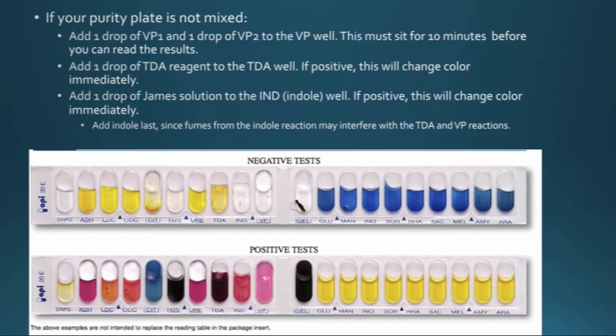After that, add one drop of the TDA reagent to the TDA well — if it's positive it will automatically turn a very dark brown. Then add a drop of James solution to the indole well — if that's positive it's going to turn dark pink or dark red right away. Always make sure you do the indole test last, because the fumes from that reaction interfere with the TDA and the VP reactions, so you do the other ones first and then do the indole last.